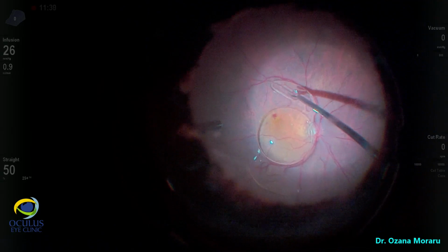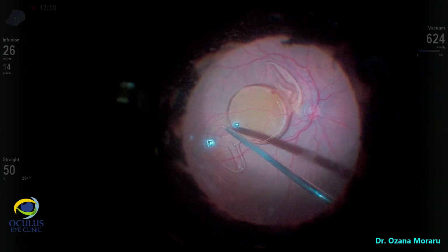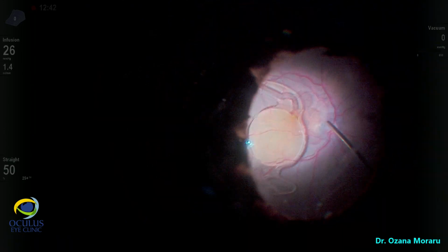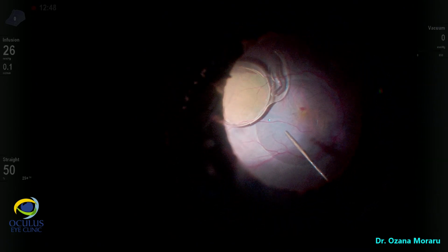First, we tried to remove it with crocodile forceps, but it didn't work. The haptics are quite large. Then we tried to use the cutter with very high vacuum, but again, it didn't work.